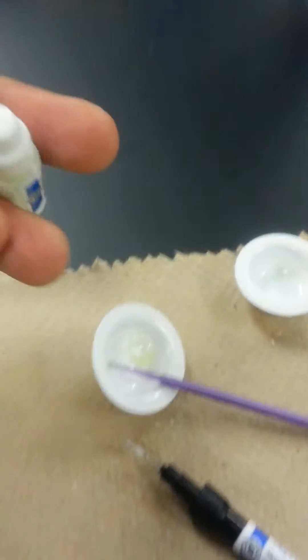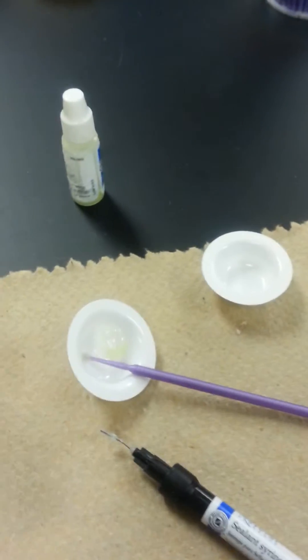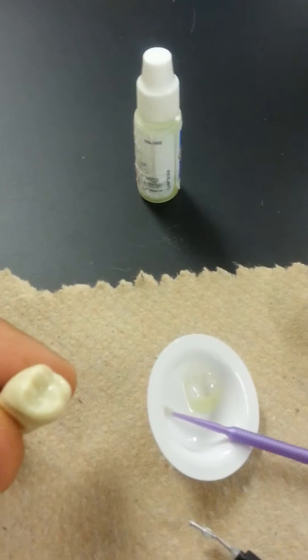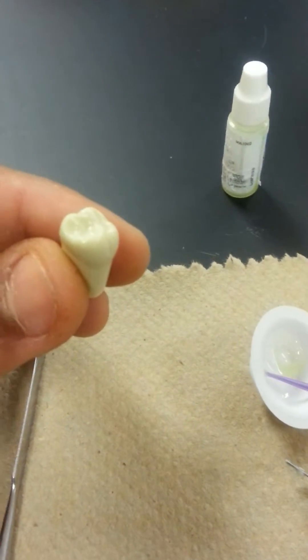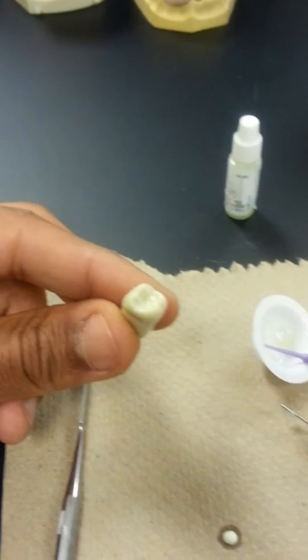I put one drop of etching in the dappin dish. I used a brush to put the etching on the tooth. I waited 30 seconds — I've already etched the tooth, so 30 seconds has passed. Then I put it in water for 20 seconds.